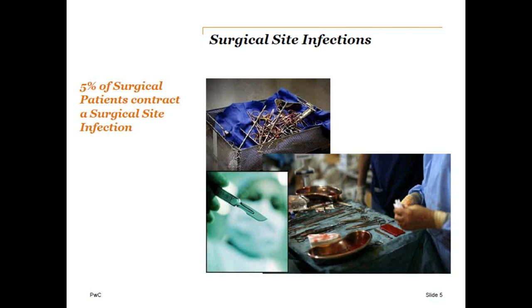The hospital didn't have a traceability solution in place. So all patients that had undergone surgery that day in the hospital had to be called back to be told they could potentially have contracted CJD. This was giving stress to 24 patients, unnecessary stress. And also because they couldn't identify which surgical instruments had been contaminated, they had to destroy every single instrument in the hospital because CJD cannot be sterilized and removed from instruments. So this was £90,000 worth of instruments destroyed. But thankfully, I suppose, CJD is not that common.